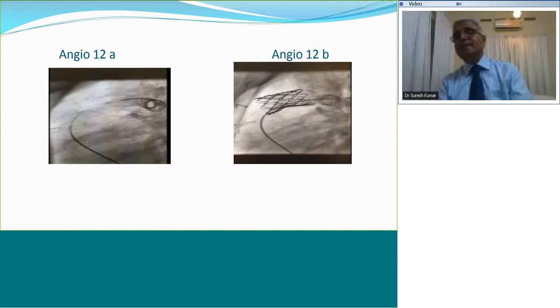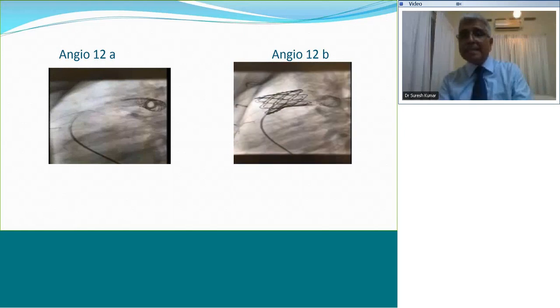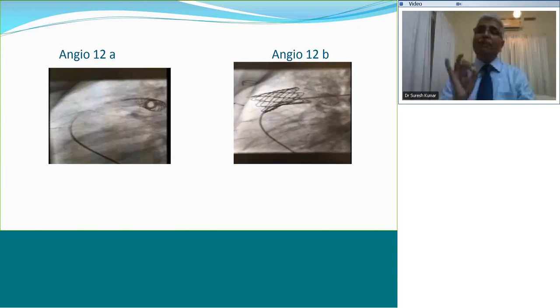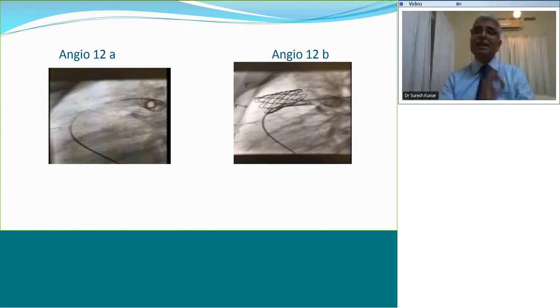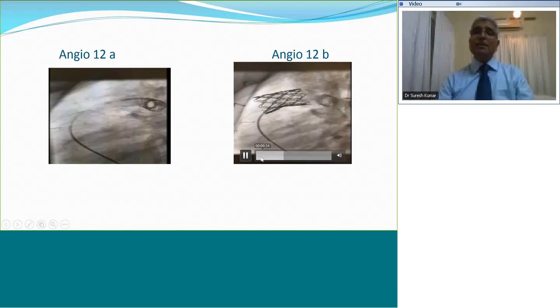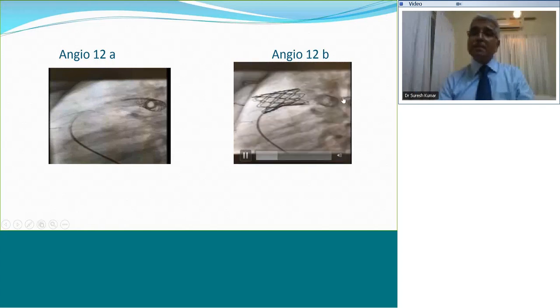Now, why is it that somebody thought it is a transcatheter stent and you said pulmonary valve? What is the one finding based on which you can say that a valve has been implanted, apart from recognizing the appearance? The pulmonary regurgitation has disappeared. You see this? In the first, yes, very good. It's a Melody valve and there is no PR. The injection is now well into the pulmonary artery. And where is the PR? You are opacifying only the MPA and branches.